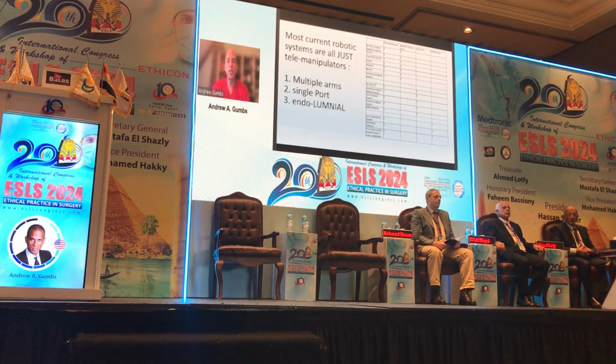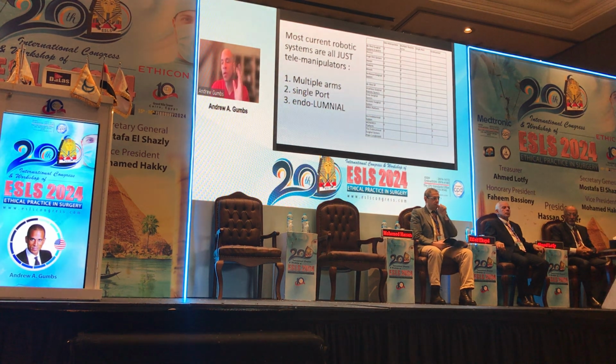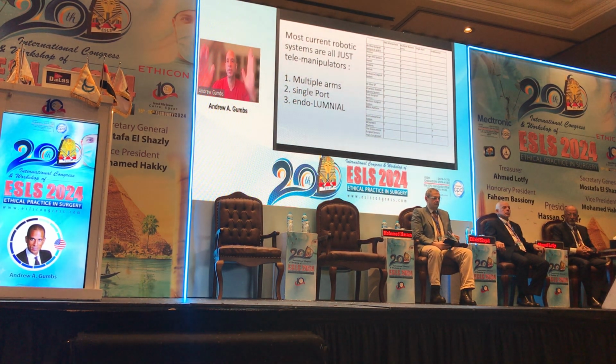So I just want to go back to talk about what complete surgical systems there are. This is a surgical conference. I am a surgeon, so I just wanted to go over quickly the types of robotic systems that there are so we can better understand handheld robotics and non-console robotics.